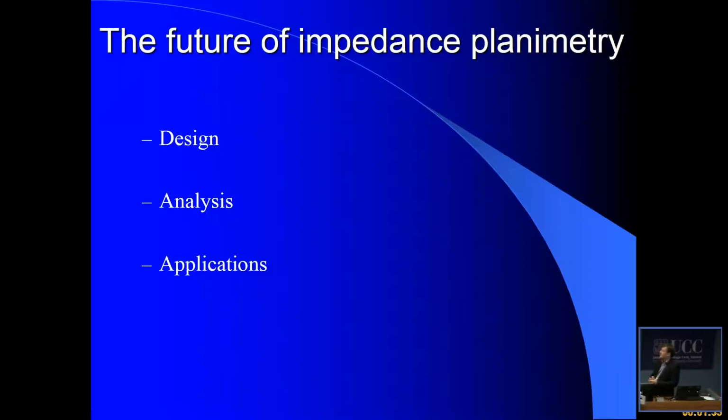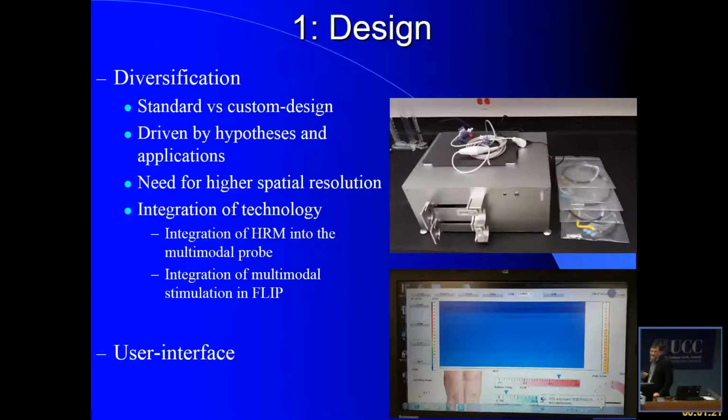So the talk was about the future of impedance planimetry. I think what you have seen will to some degree be the future. But we need to discuss this in terms of design, analysis, and applications. And I think for the design, in the future, we will see a lot of diversification.